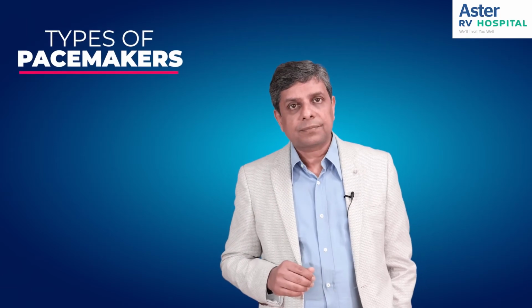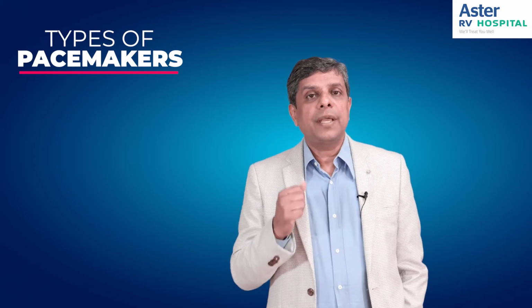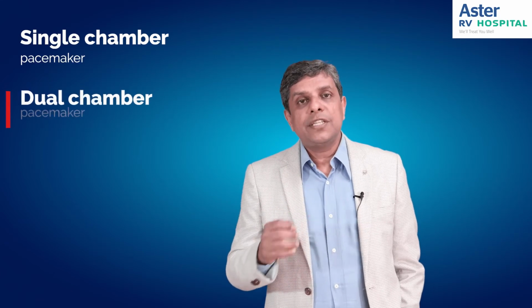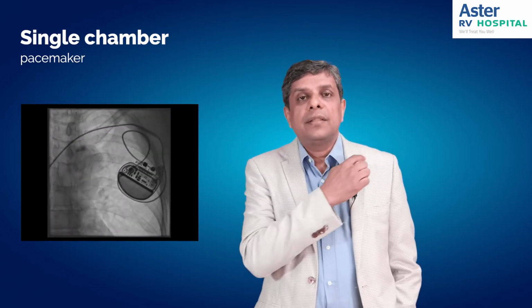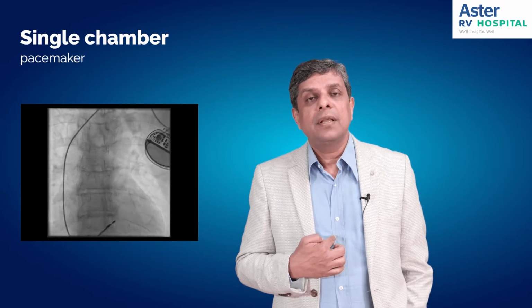Now, are there different types of pacemakers? Basically, we talk about, in terms of slow heart rates, two types of pacemakers. One of them is called a single chamber pacemaker. The other one is called a dual chamber pacemaker. Now, a single chamber pacemaker has a single wire, and the pacemaker sits here. A single wire goes into one of the chambers of the heart.